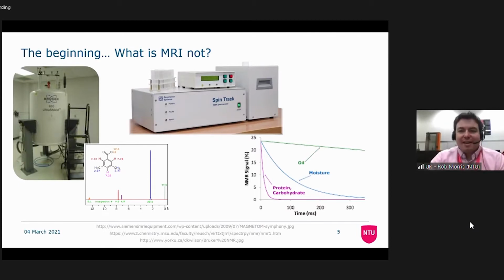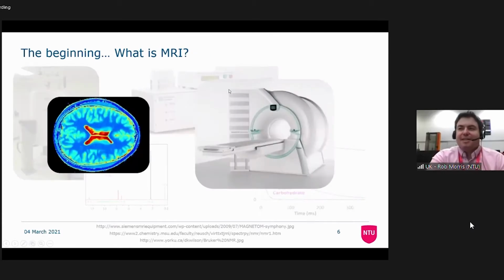Now, the MRI can do some of those things, but the thing that the MRI is really good at is making pretty pictures. This is a picture of my brain from when it was young and filled with youthful excitement on an MRI scanner, and this is obviously what they're really meant for: to scan people and look inside non-invasively and get a feeling for what's going on in the tissues. Obviously, we don't really care so much about that here.